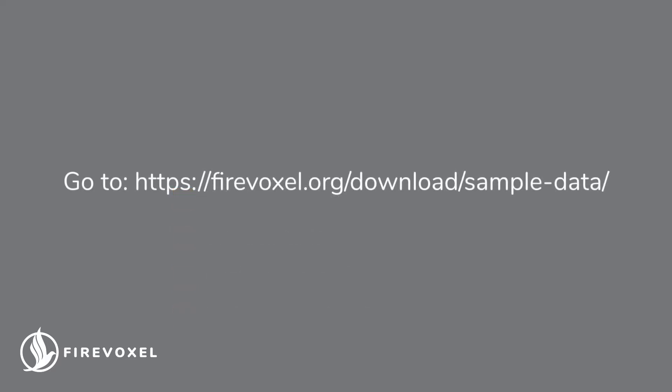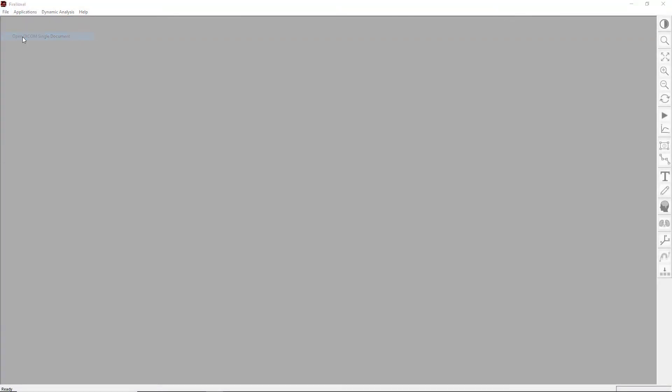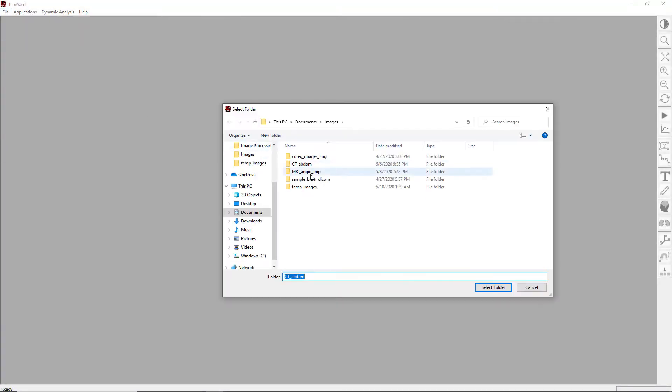If you want to follow along, please download sample data from our website and extract them onto your hard drive. First, let's import a set of DICOM images.